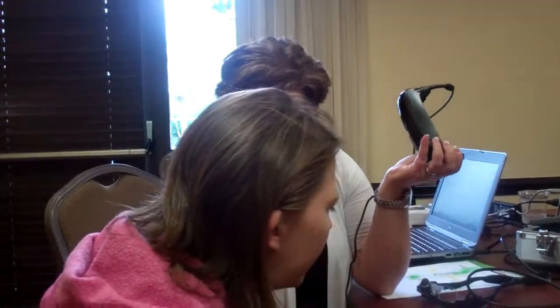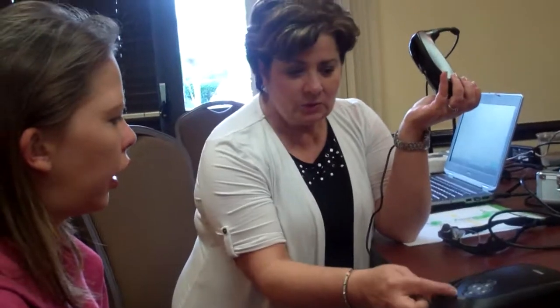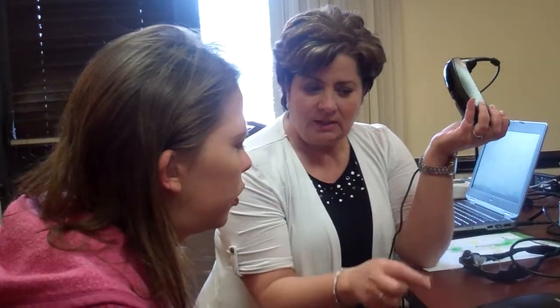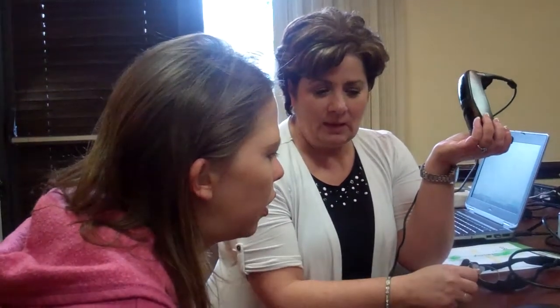When you see the image, you can then manipulate it to what you need, and that's by using this controller. This is always attached, it never comes undone. The large knob is the magnification, or your zoom. Turning that knob to the right will increase the magnification, kind of like a radio dial. The little knob to the right is a contrast wheel, very cool for anybody that has low vision. One turn to the right makes things brighter and more defined.